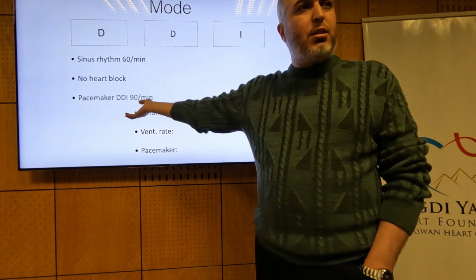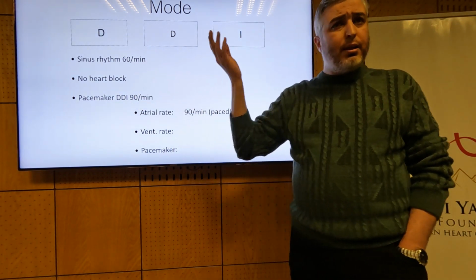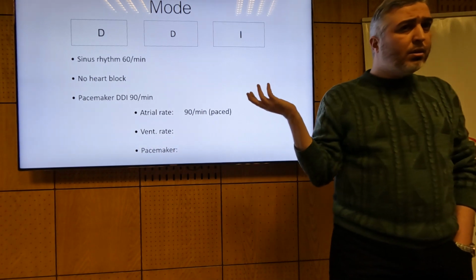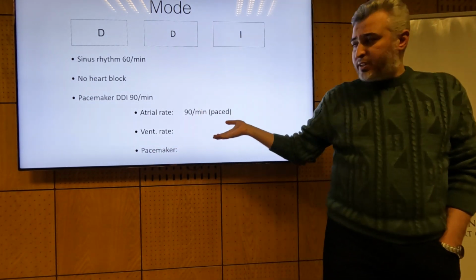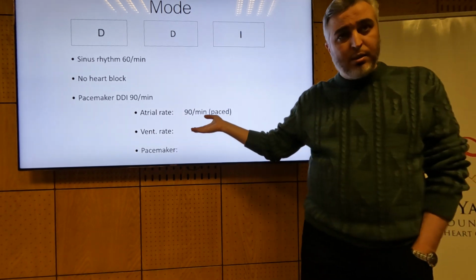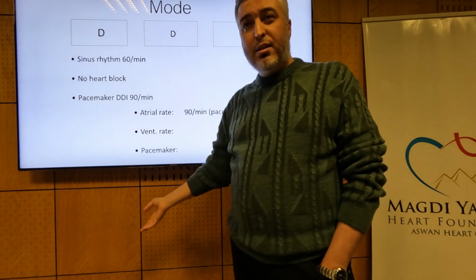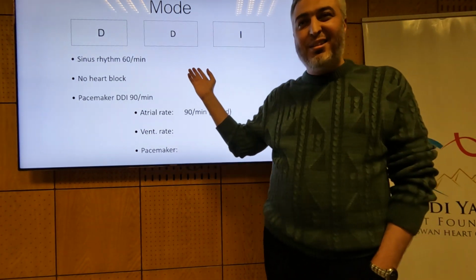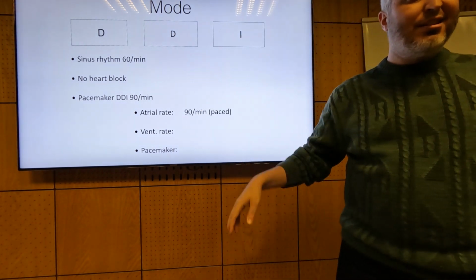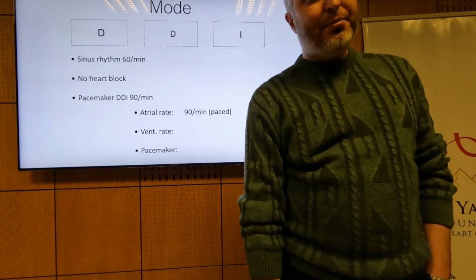I mean, you have just paced atrial, and then why doesn't that get conducted to the ventricle? You can. There's no heart block. So the ventricular rate is 90. Is that conducted? Yeah. But you're also pacing at 90. So are we pacing or conducted? Simply causing the delay. Exactly. Okay, so it depends.